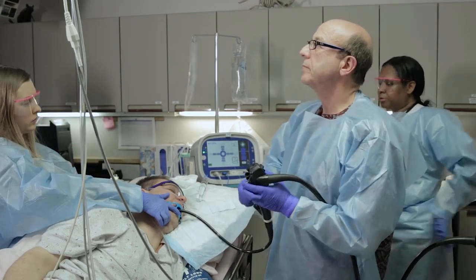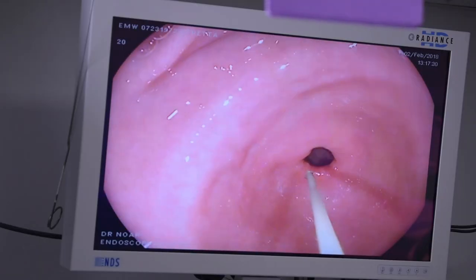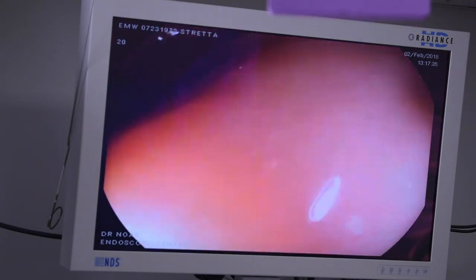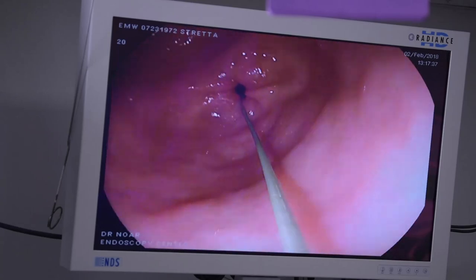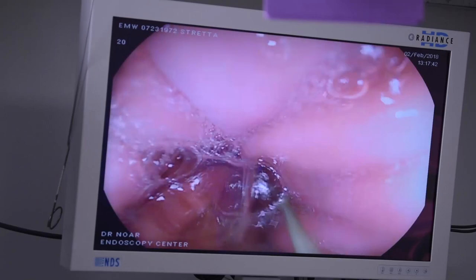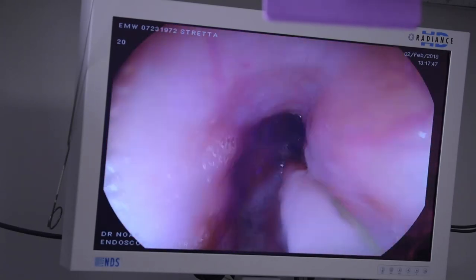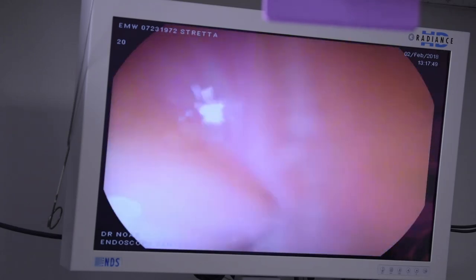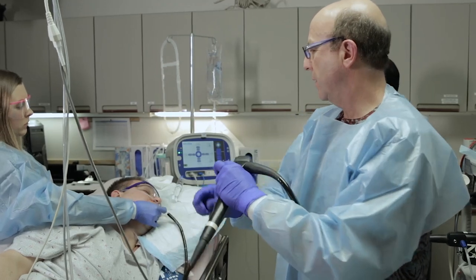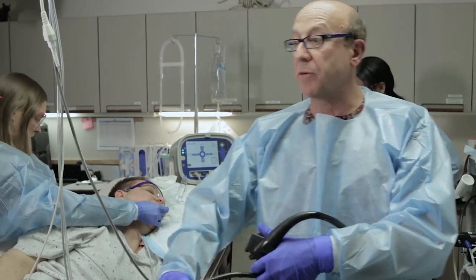We'll place that nice and deep. This just serves as a guide for the catheter — that's its only purpose. We'll remove any remaining fluid, slowly push the endoscope out using the wire, the nurse will grab that wire and stabilize it, and we'll remove the endoscope and move on to the actual Stretta procedure itself.